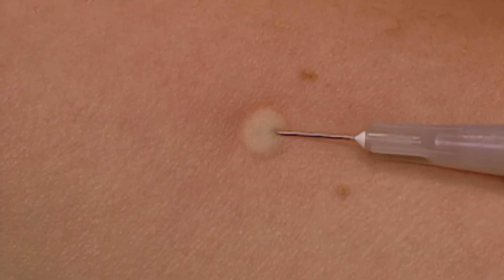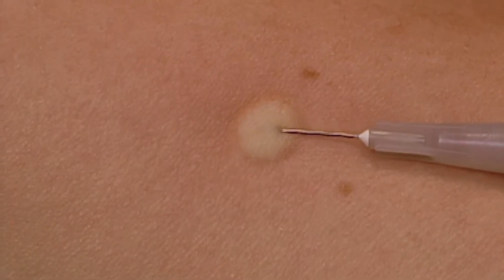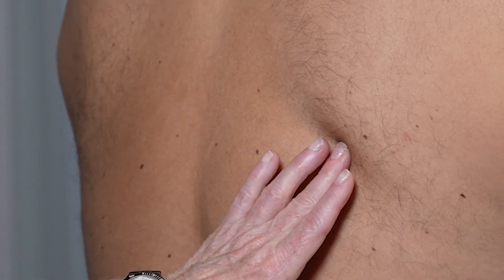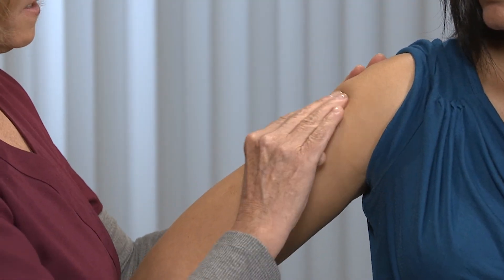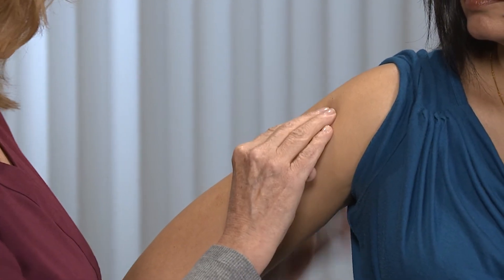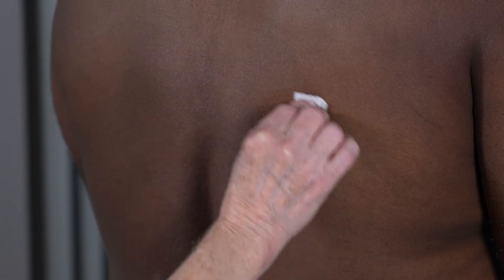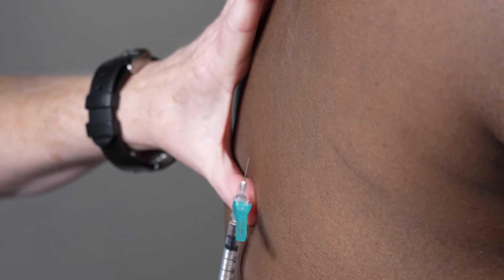A wheal does not always appear; there is no need to repeat the dose if a wheal does not appear. If the patient is concerned about receiving the vaccine on their forearm, they can be vaccinated in the upper back below the shoulder blade, or the skin over the upper arm in the deltoid area. Clean the skin of the upper back for injection, then pull the skin taut and insert the needle at a 5 to 15 degree angle.